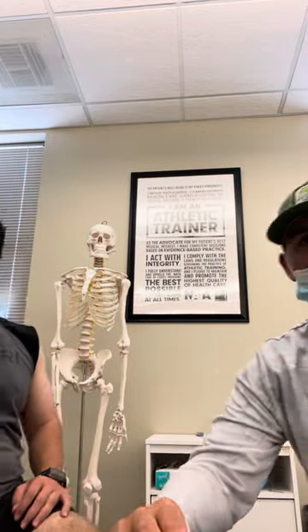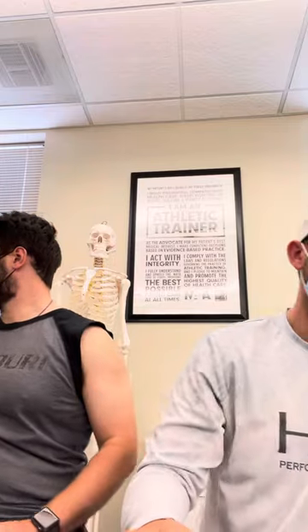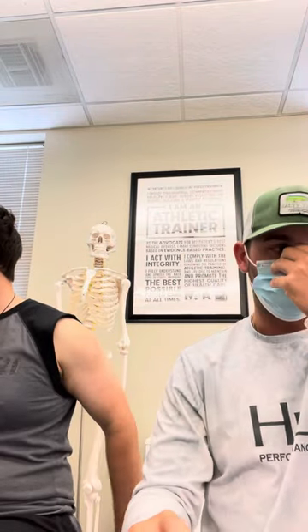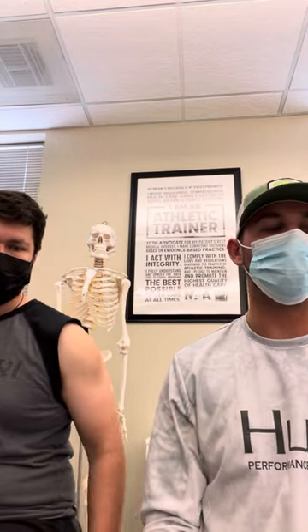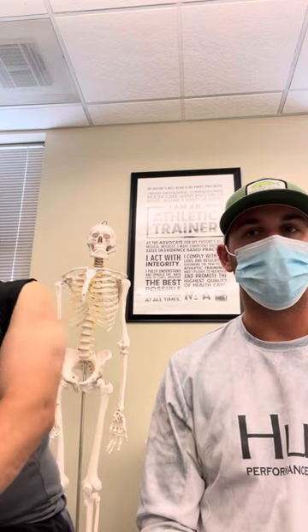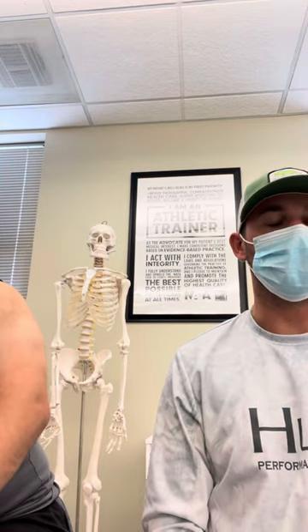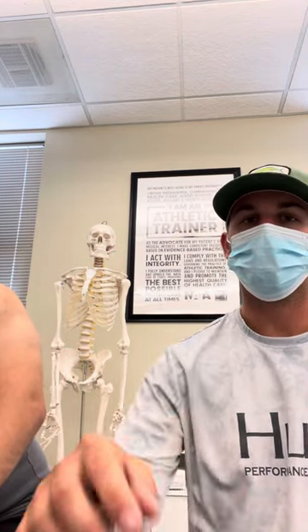And then I was listening for the presence of air. We're going to know the frequency, how loud it is, the quality of each breath, and then how long each breath was.